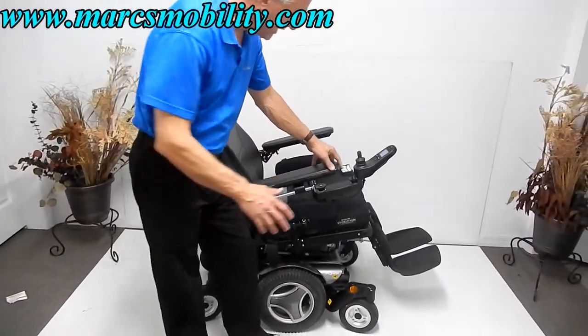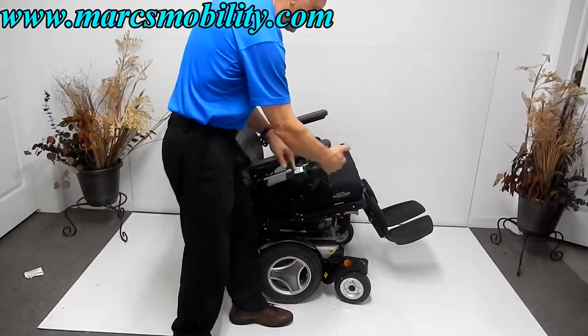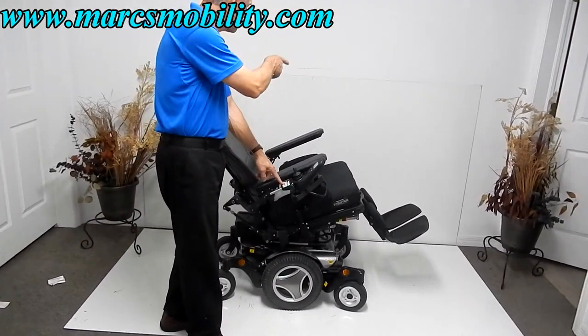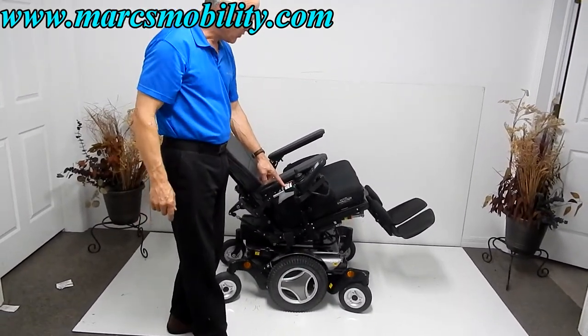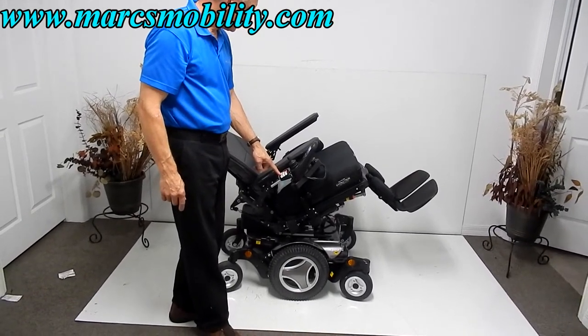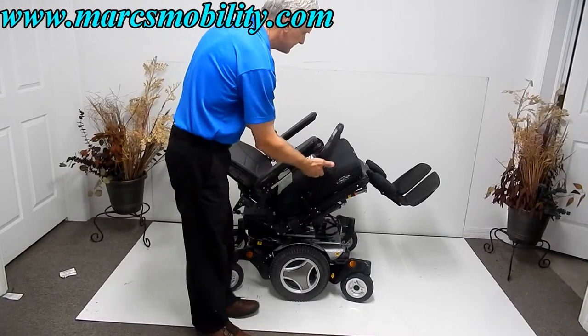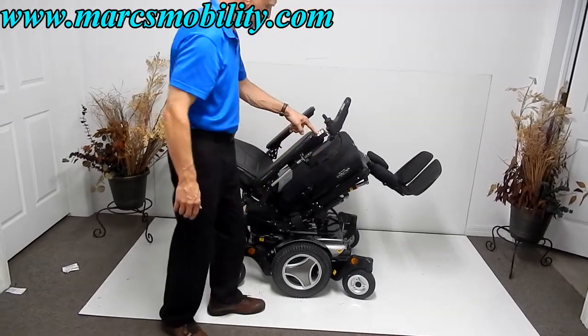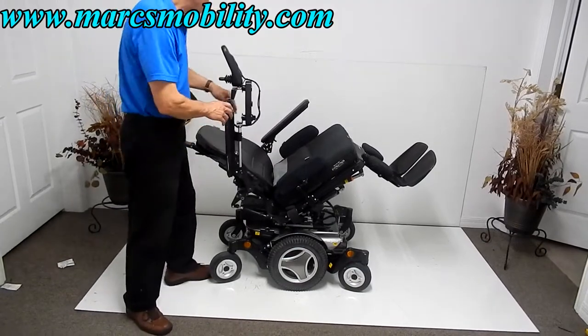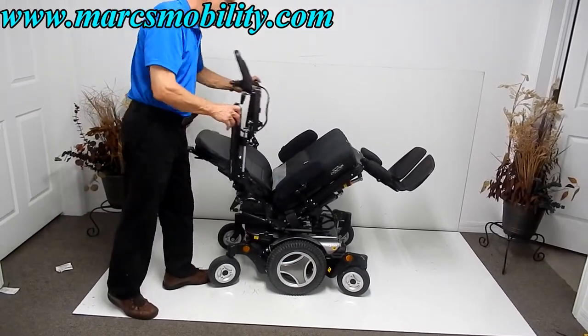This chair has everything. It also has a swing-away joystick. You can put the joystick on the right or switch it to the left depending on whether you're right-handed or left-handed. The arms are adjustable, so you can raise them up and down for easy access on the chair.